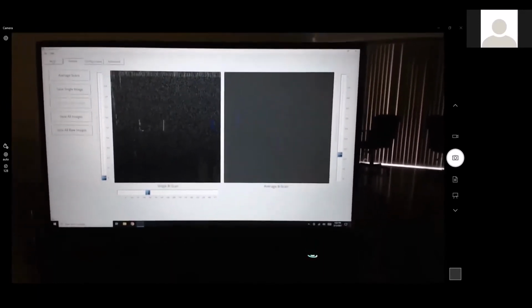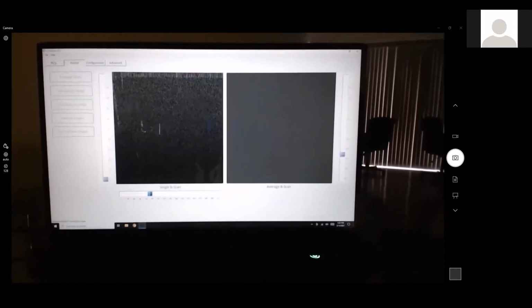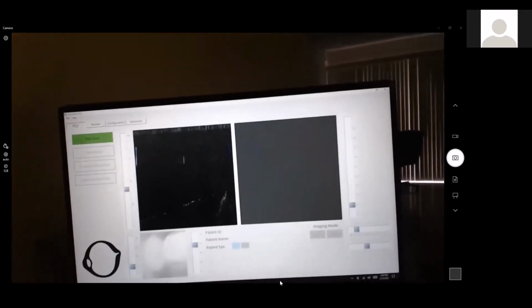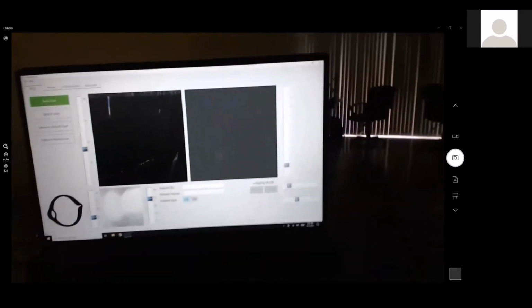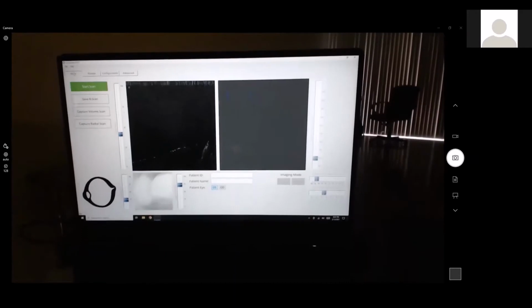That's for the anterior. Okay, so let's move on to, I haven't checked for questions here or anything as we're doing. If there's no other questions on the cornea or anterior side, we'll go over to retina. Okay, so let's go ahead. You want to do that, Sean, before we're into the retina side?